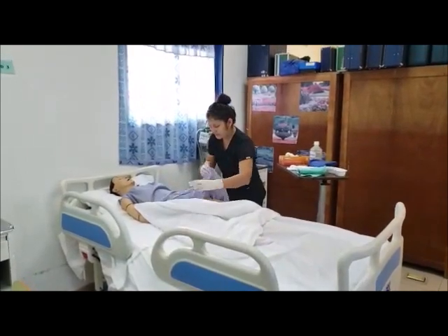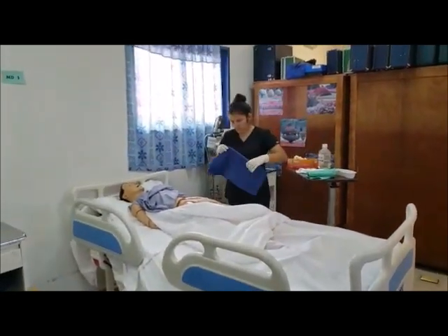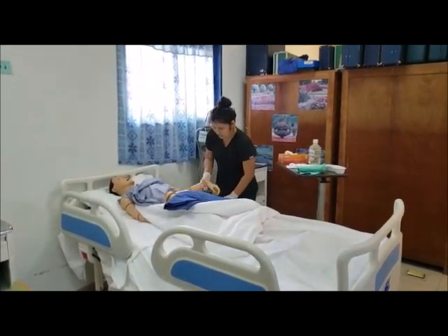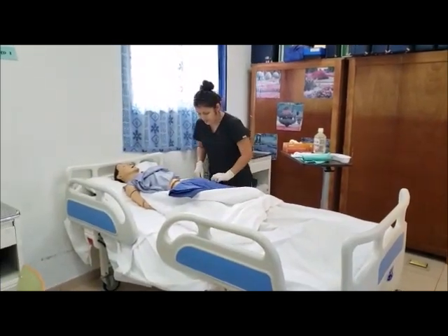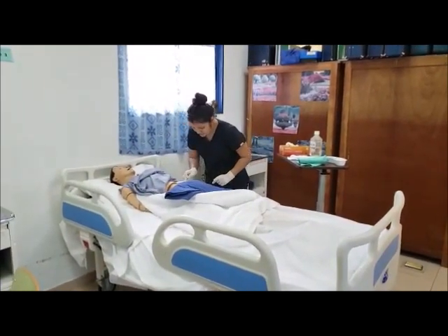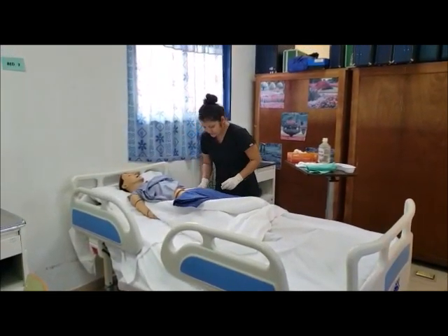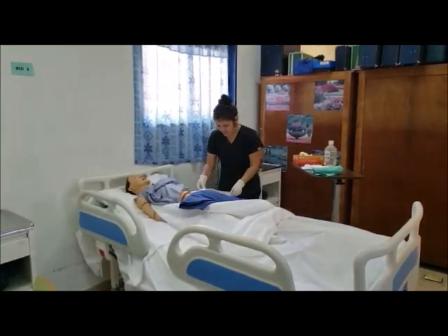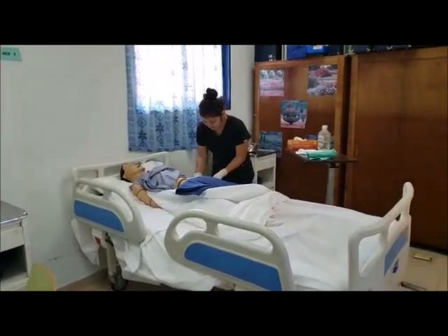Place drape over client. Place absorbent pad or towel under client. Observe placement of stoma. Empty pouch into measuring graduate or bedpan if needed to quantify. It's going to be emptying it out, okay?